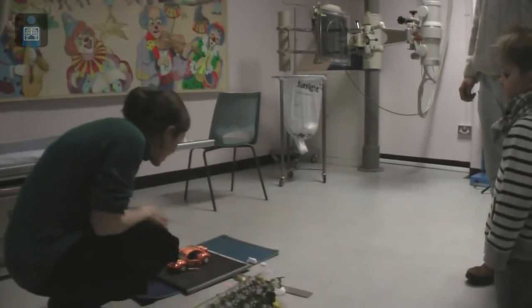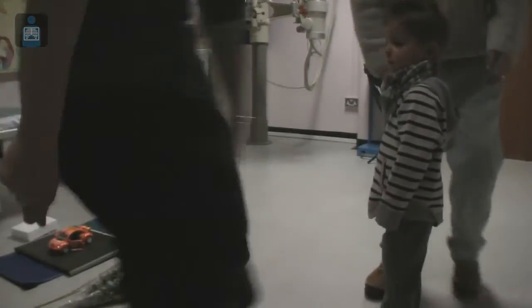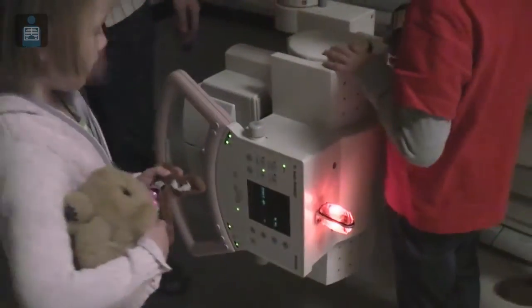The x-rays are going to get stopped by the object and they're going to reach the camera. Shall we go and take an x-ray? Yeah, let's have a little look at the energy. And this is where the x-ray comes from.